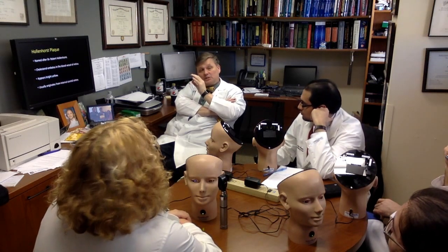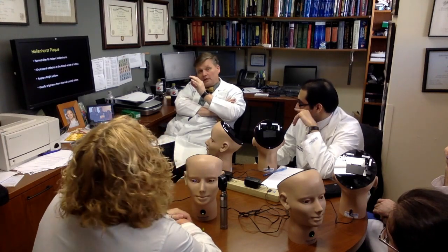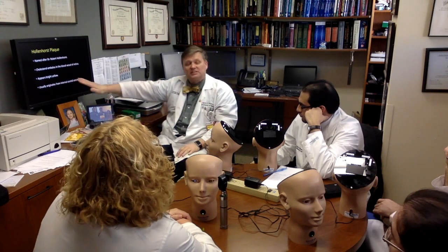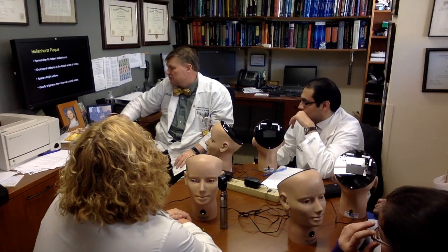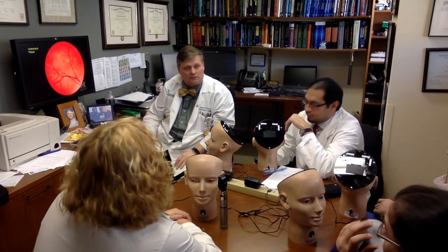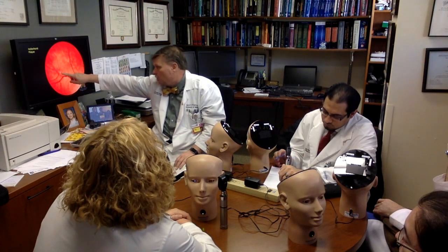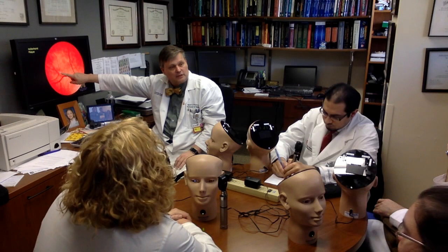If the plaque has cholesterol in it, it can go up and get stuck in the retina, and it often gets stuck at a branch point. It'll appear extremely yellow. It's so refractile. So this is what a Hollenhorst plaque looks like. Here's the artery going out, and boom, it's stuck at the bifurcation.